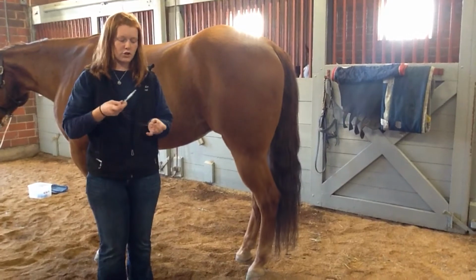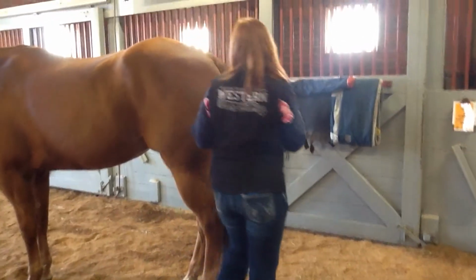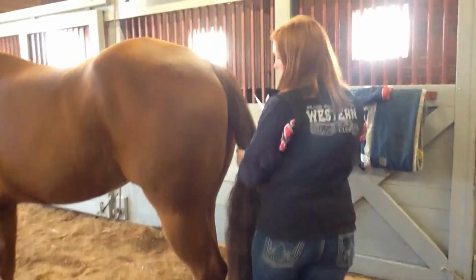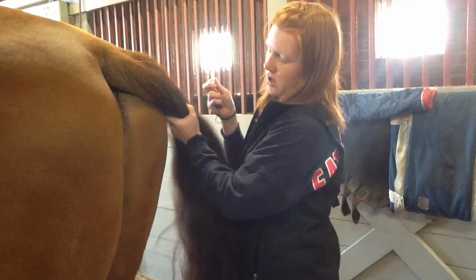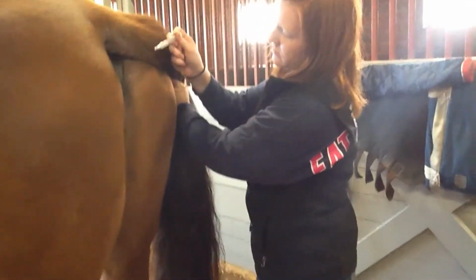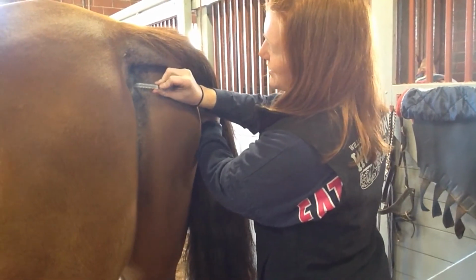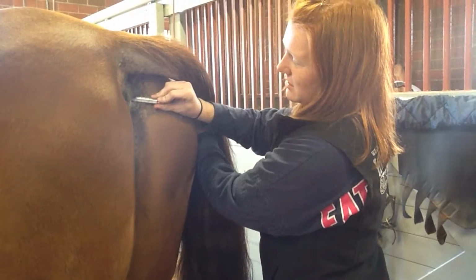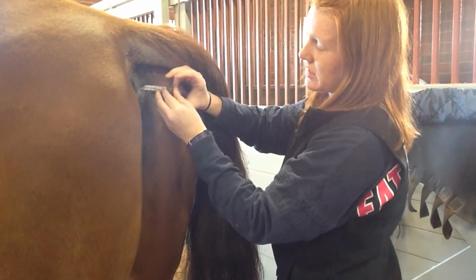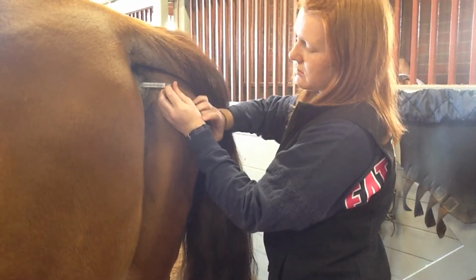With your thermometer, you're going to insert it at an angle, or straight and then tip it to an angle. You also want to stay out of the road of your horse, and for this video I'm going to stand on the off side of the horse. I'm going to insert it straight and then tip it to an angle. For a mercury thermometer, you're going to let it sit for 2 minutes, 3 minutes if they'll actually let it stay there.